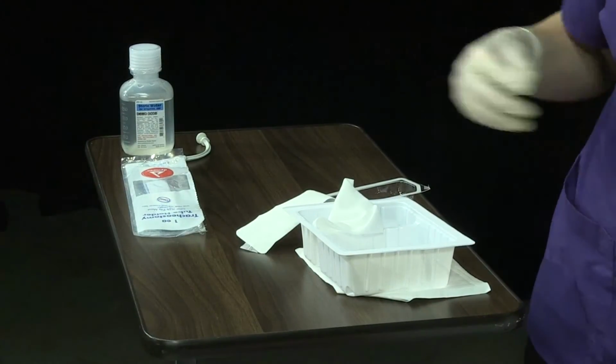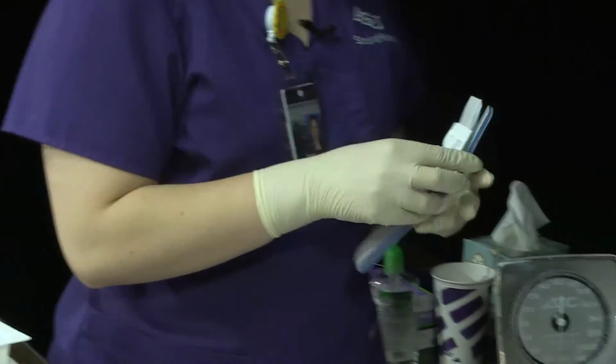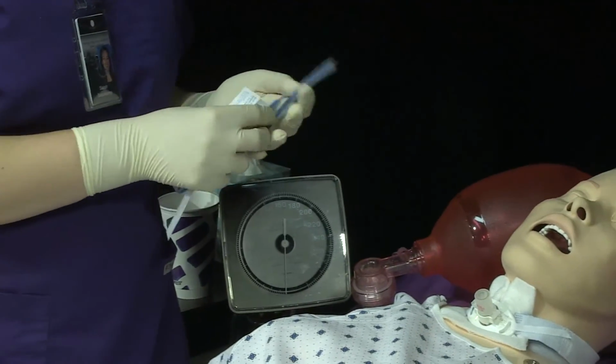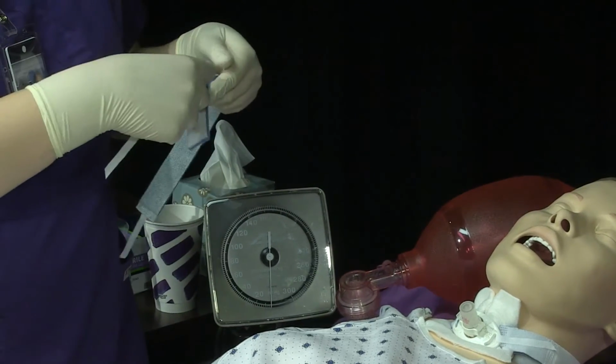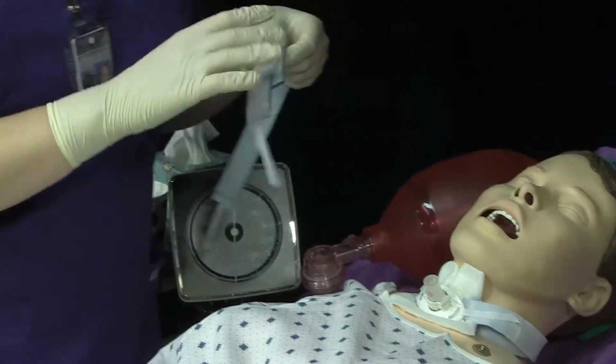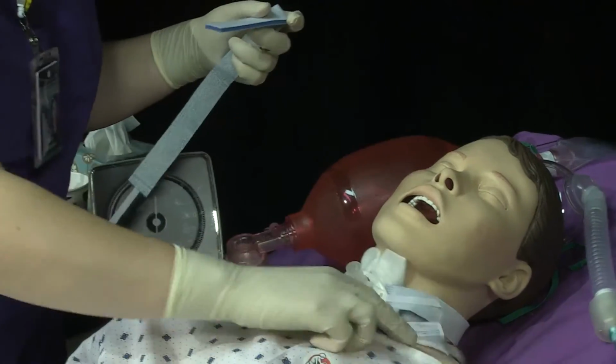Change Velcro tracheostomy tube holder. Secure new holder. Do not remove the old holder. Place holder around back of patient's neck and insert the ends of the holder in the faceplate to secure.